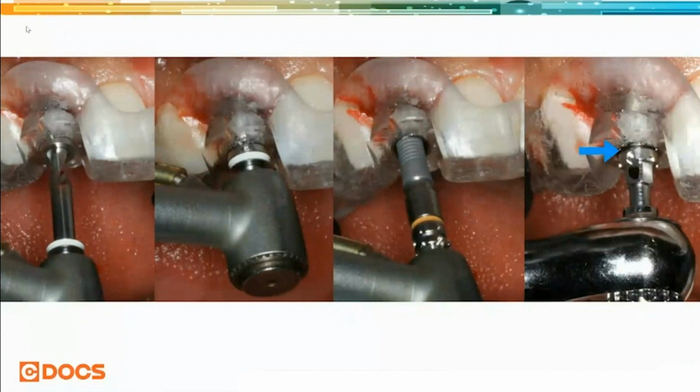And the way that Azento is able to make a custom tissue former and for immediate cases give you an Atlantis abutment and a temporary crown that's pre-made is because the timing is controlled for depth and rotation of the implant. So they make sure with the notches on the implant carrier there that you can see, the metal kind of horseshoe shaped notch, along with the notch in the surgical guide, that surgical timing is controlled for rotation and depth.